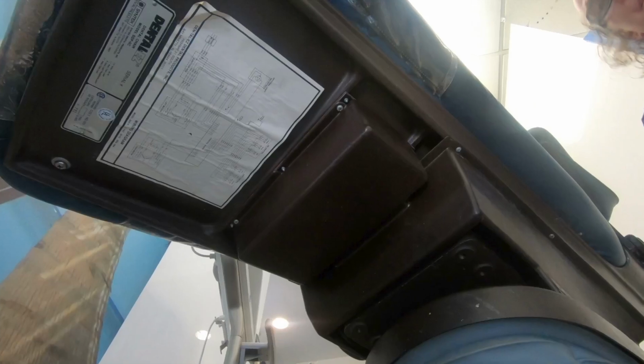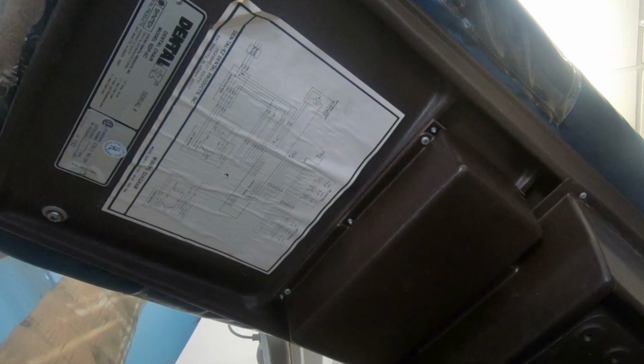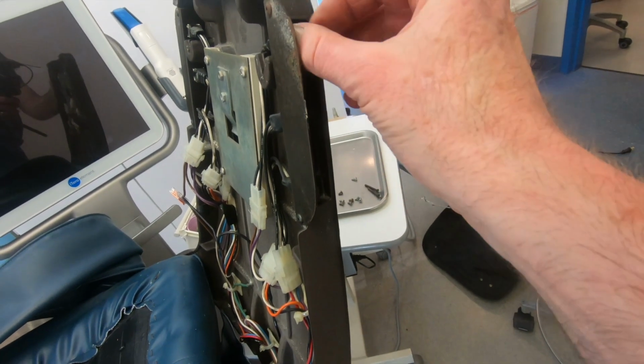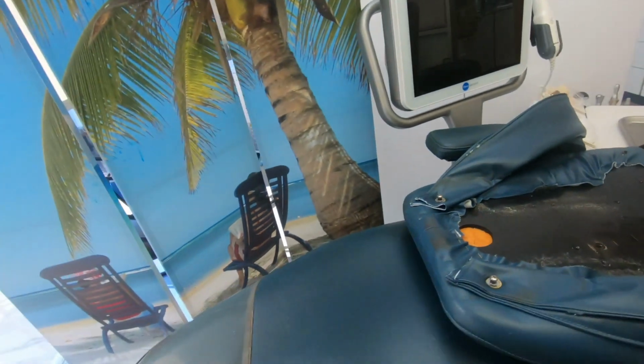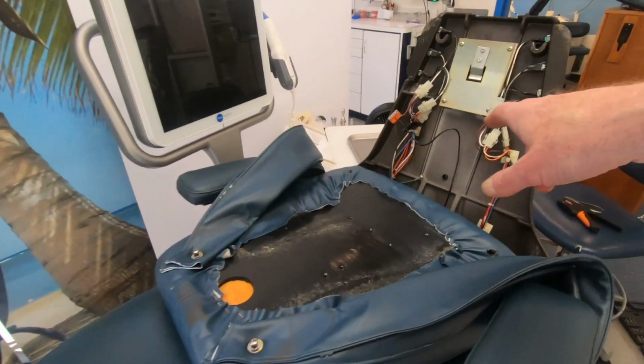So luckily that was the issue. It was basically the wire somewhere underneath the chair. When I bypassed that wire, it worked, which it is now. So all I have to do is button back up the chair and connect the wires a little better with some cable ties, and it's fixed. Okay, so I don't have to connect that other. That other brown wire is just going back to here. So I'm just bypassing it with the black one.